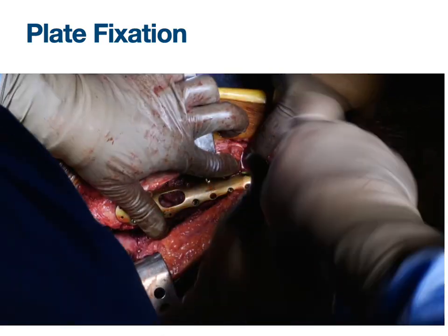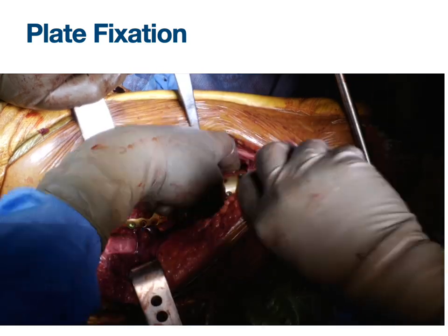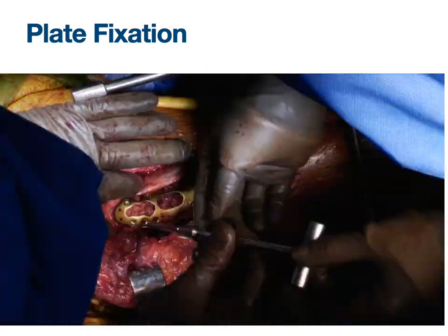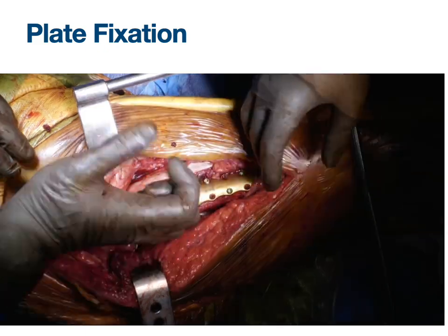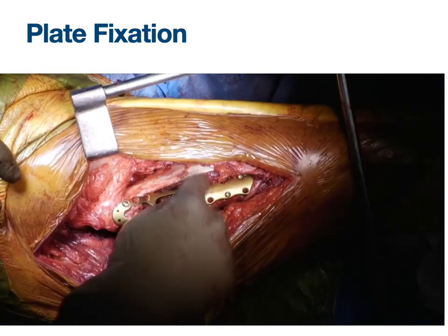Use a lateral plate when there is a lateral wall fracture, along with when you have an intertrochanteric fracture for PFN with a lateral plate plating. You'll see a big hole there to allow the screws of the PFN nail to go through. But I like this plate because it allows us to bone graft. So once this plating is done, you have reasonably stabilized the greater trochanter fracture.